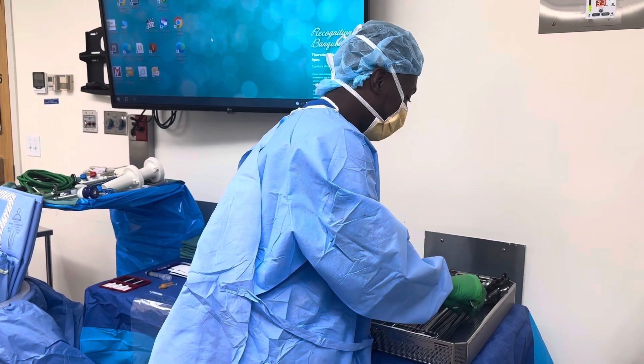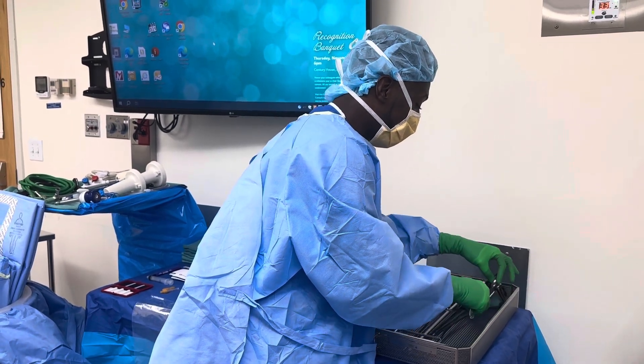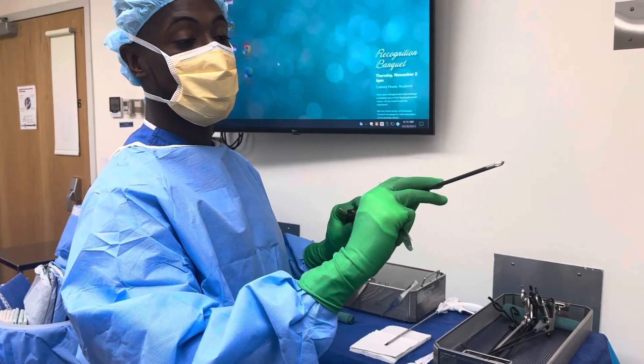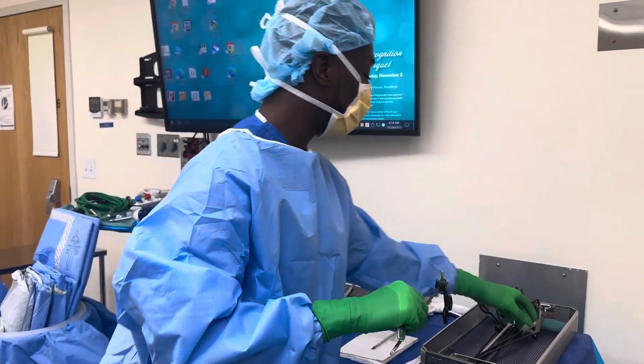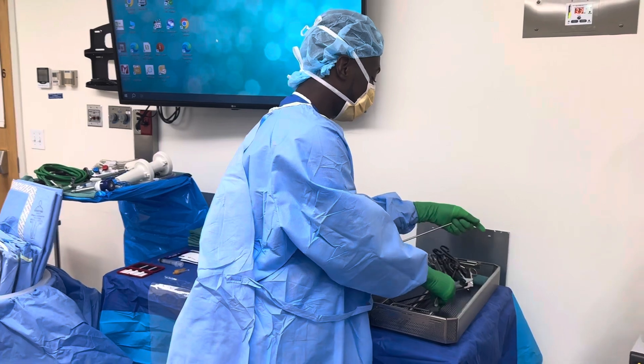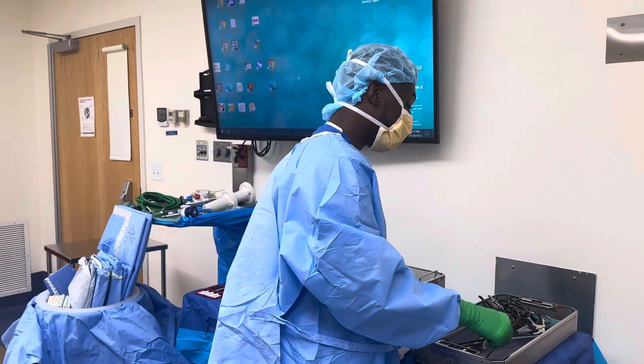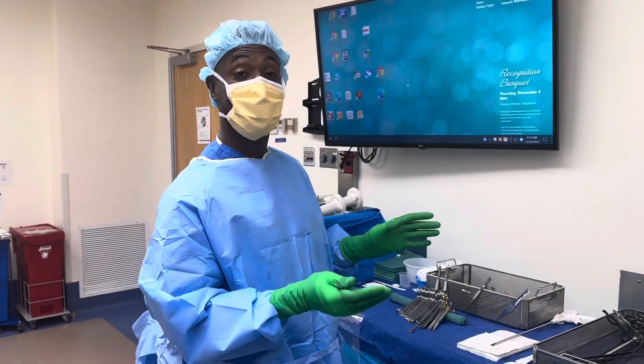The last thing that we use is the Maryland dissector. And also the suction. Yeah, that's it — this is the setup for my case.